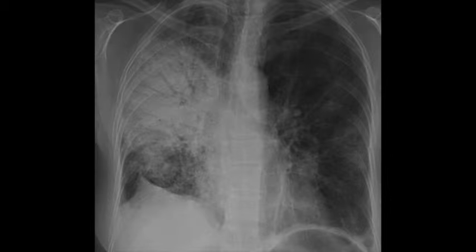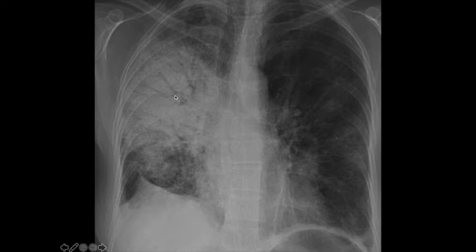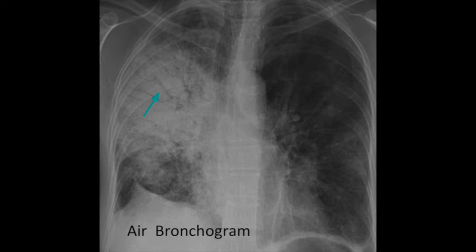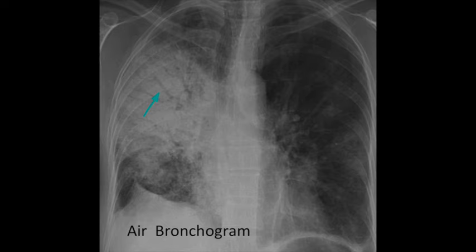Here again we have a fluffy, cloud-like opacity in the right lung — a consolidation. This patient happened to have pneumonia. You'll also notice branch-like lucencies going through this area of consolidation. This is what people refer to as an air bronchogram — normal airways branching through alveoli filled with disease. Two things to know: air bronchograms are used when talking about consolidations or airspace disease, and when you see them it means the airways proximal to those bronchograms are patent, not obstructed.